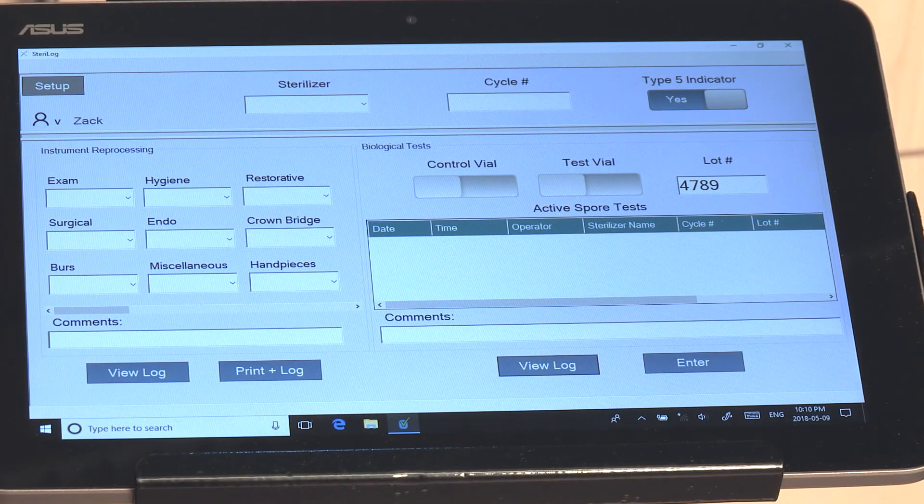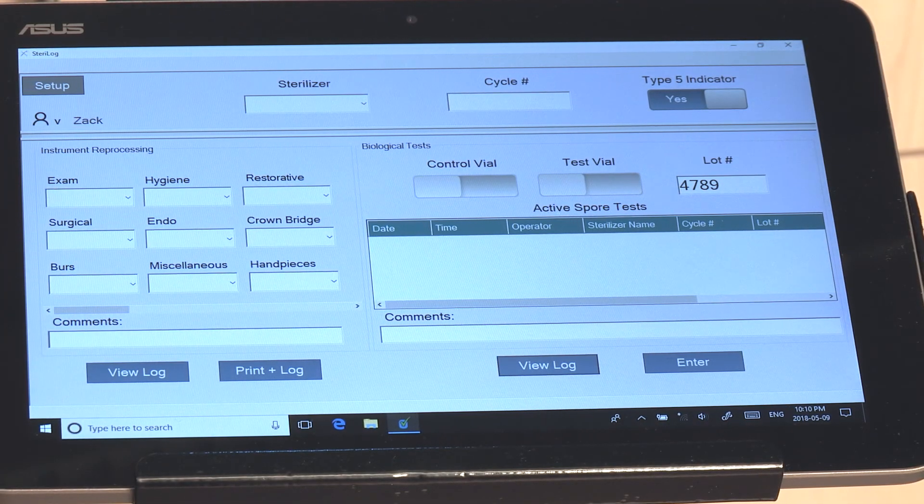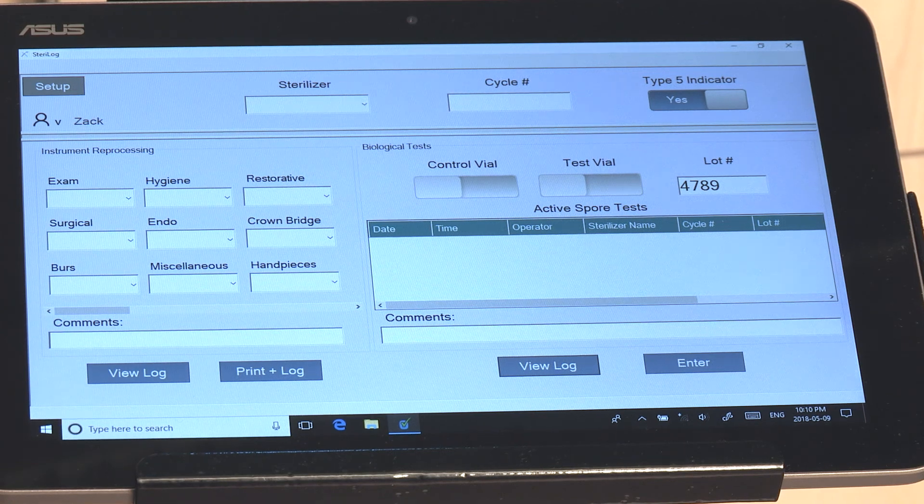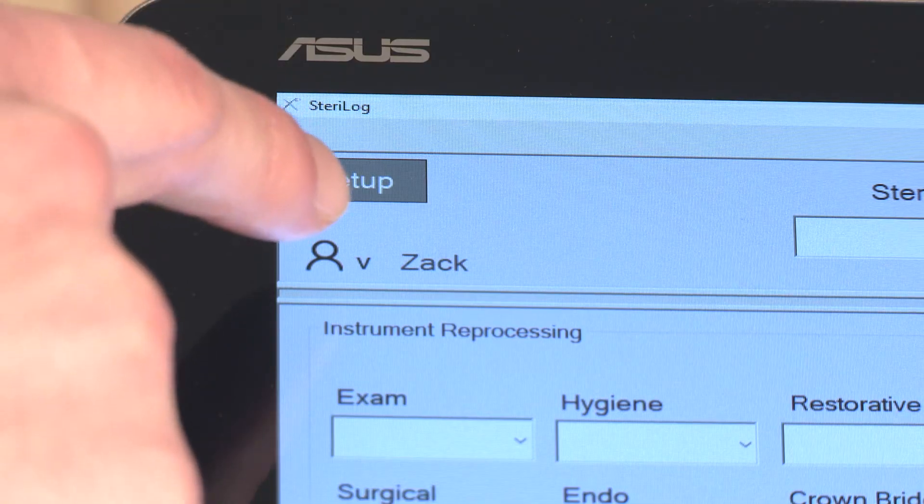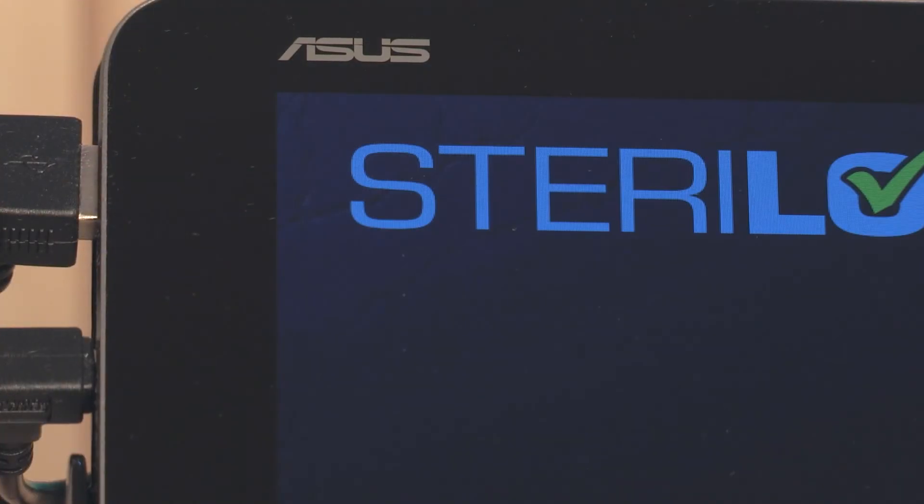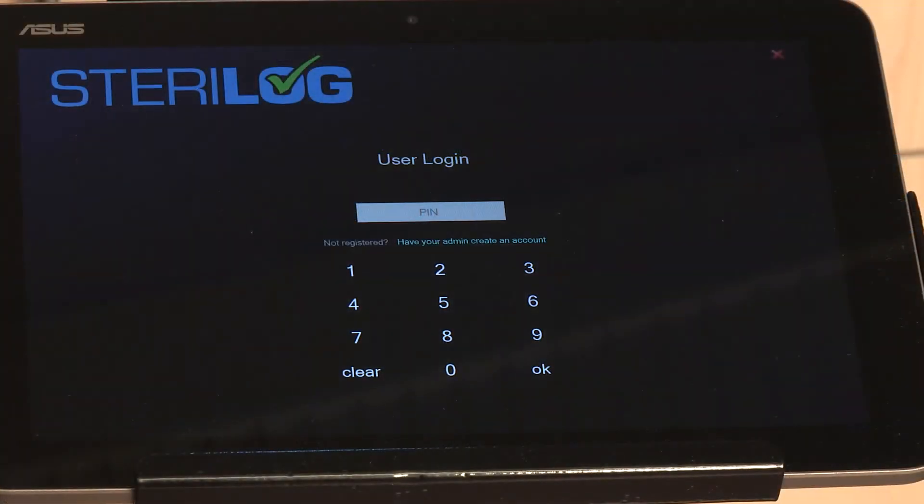To log out and switch user, simply hit the icon over here and you'll automatically be logged out and leave the machine available for the next user.